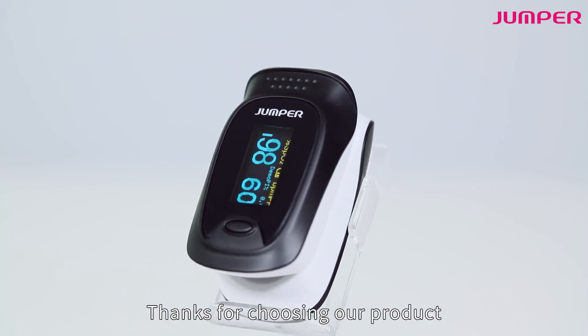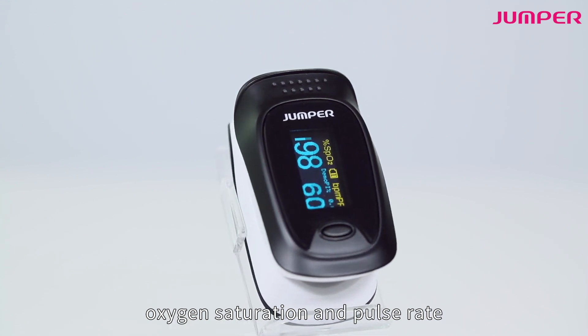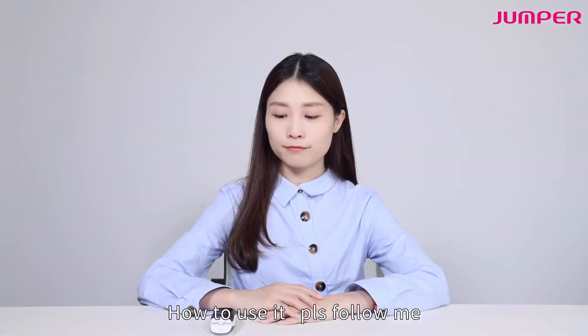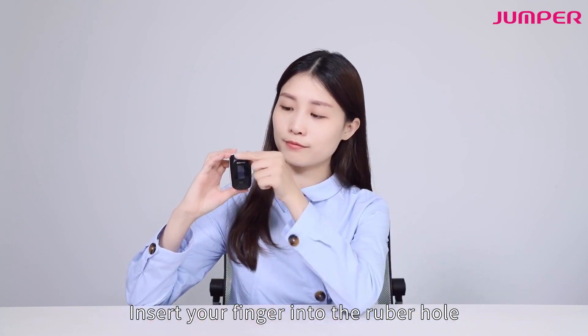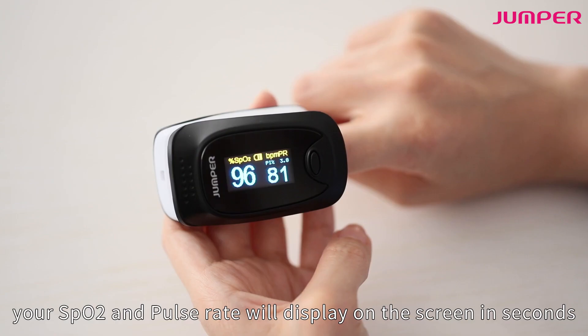Thanks for choosing our product. This pulse oximeter is used to detect a human's oxygen saturation and pulse rate. To use it, insert your finger into the rubber hole and press the power on button. Your SpO2 and pulse rate will display on the screen in seconds.